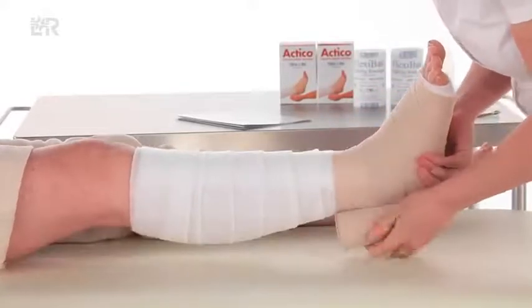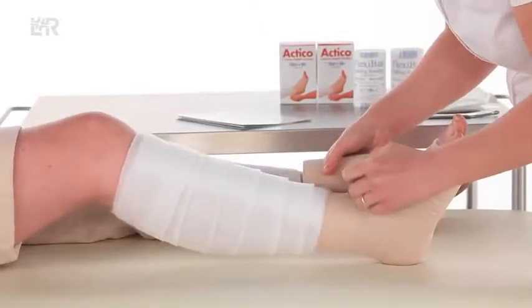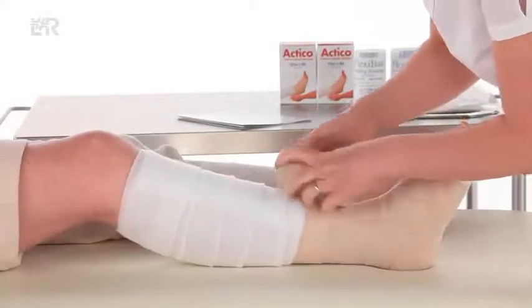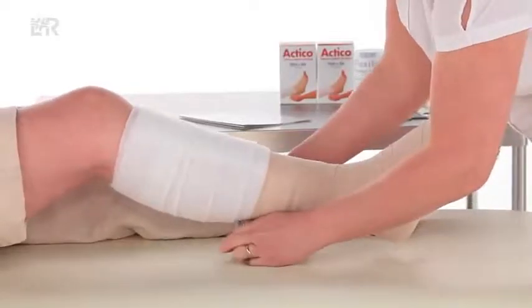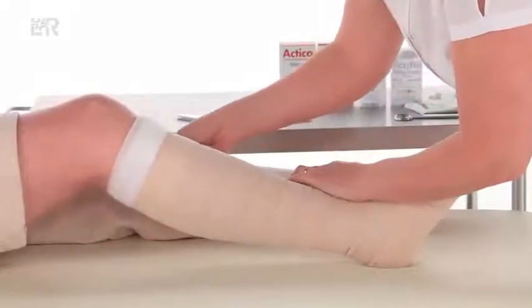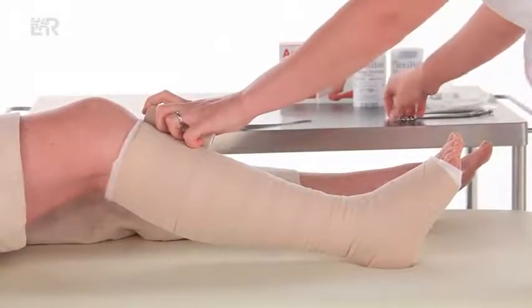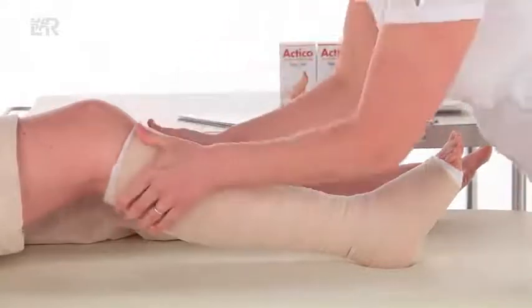Start to spiral up the leg using the lock and roll method, with 50% overlap and at full stretch. Roll the Actico round the back of the leg whilst ensuring it is locked out at full stretch. Continue with the lock and roll method up the limb in a spiral. Finish the Actico three centimetres below the popliteal fossa. Cut off excess bandage and tape if necessary. Ensure layers are bonded.